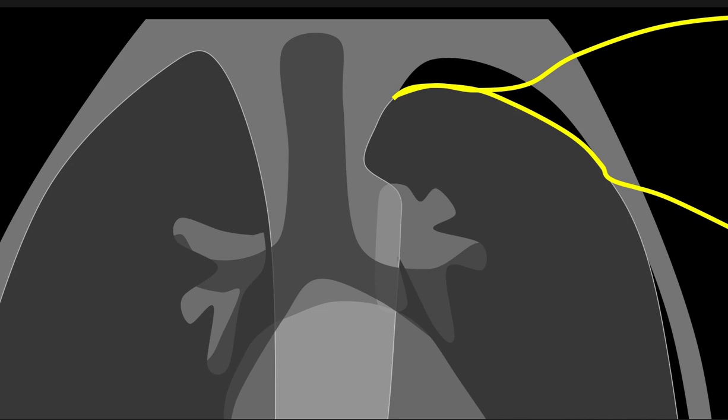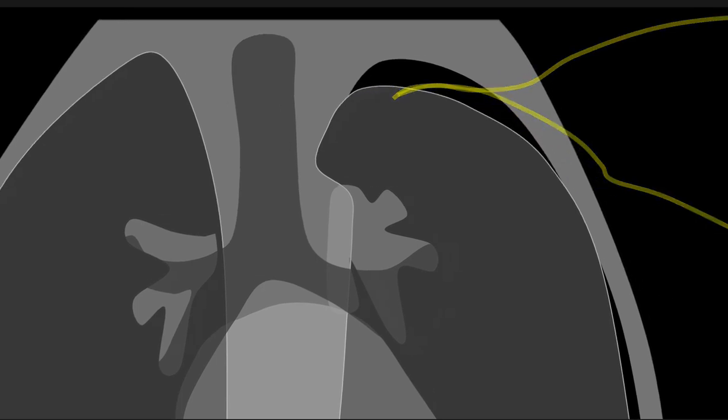So you don't want that white line to come off the patient like that, because that pleural line can't do that, right? So when you see that, you're like, maybe that's not a pleural line, maybe that's a bed sheet, or maybe that is a skin fold or something like that. So we don't want to see it go across the skin and run off the patient like that. That can't happen. It needs to follow the contour of the pleural cavity.